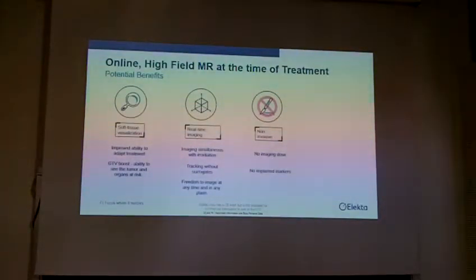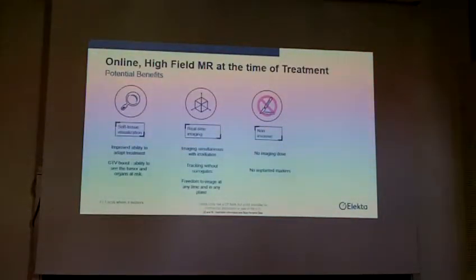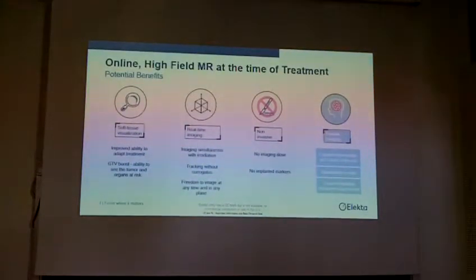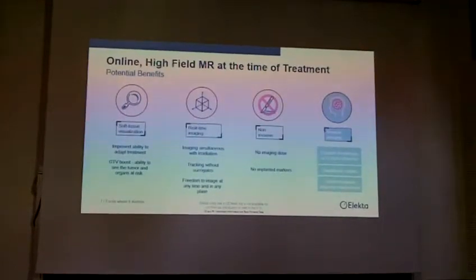Thirdly, it's non-invasive. You have no extra dose to the healthy tissue, no imaging dose, and no implanted markers. And beyond the imaging, you will have a totally different knowledge and information during the treatment, the dose you deliver, then also the quantitative results, and also how the tumor is responding to your treatment. That's very, very important.